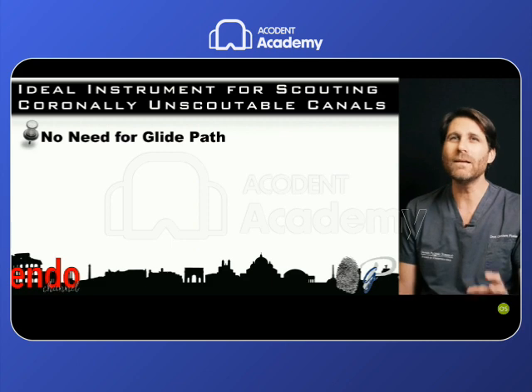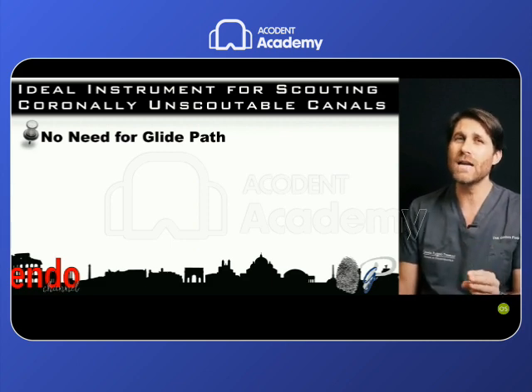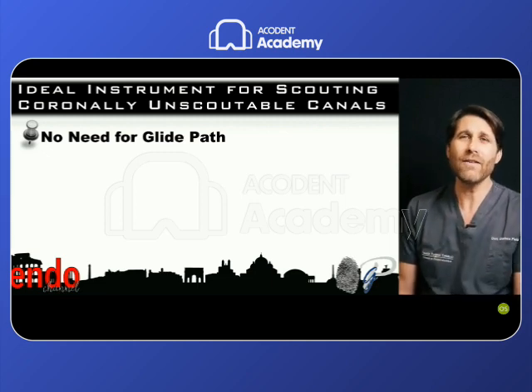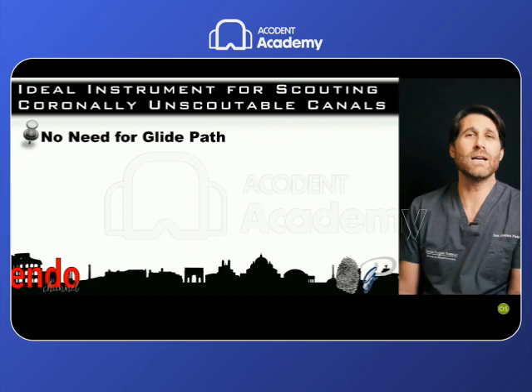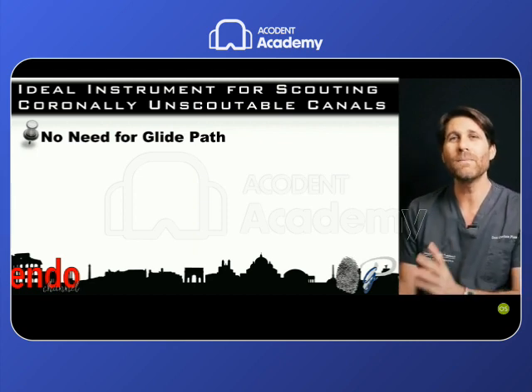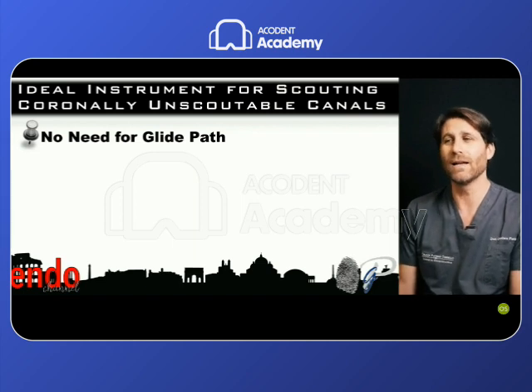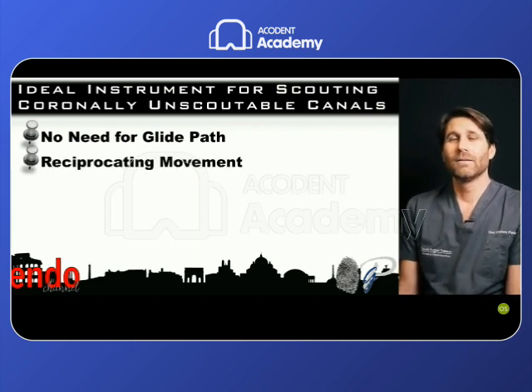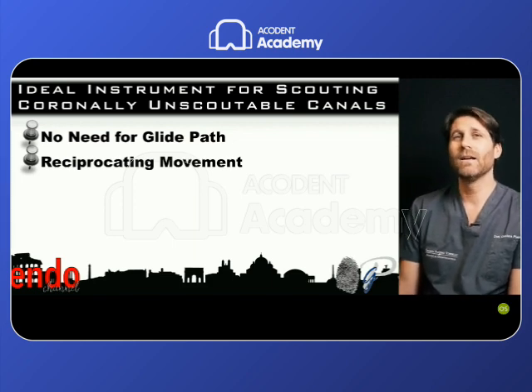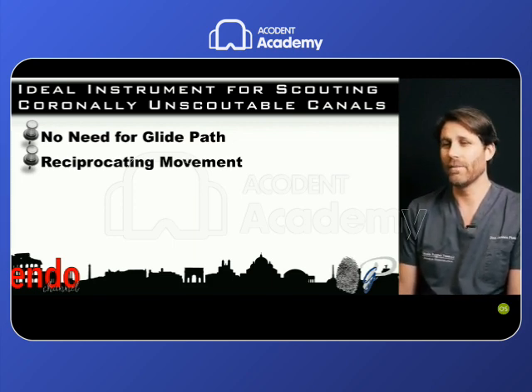So we stopped before working with these manual stainless steel rigid files, before creating a problem, a ledge or an error. So in this case, we don't have a glide path. So we cannot use an instrument that must be used only after the creation of a glide path. So we need an instrument that doesn't need the glide path. And this is an instrument that is used in reciprocation, as we have seen in the lesson on the ideal instrument for root canal preparation.